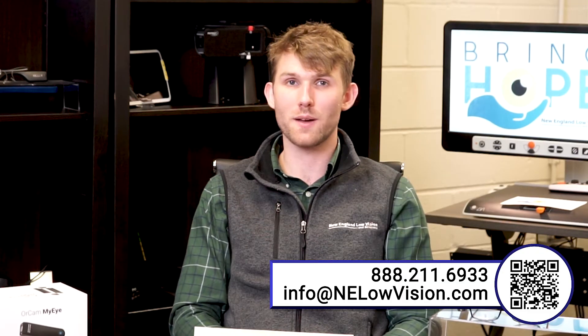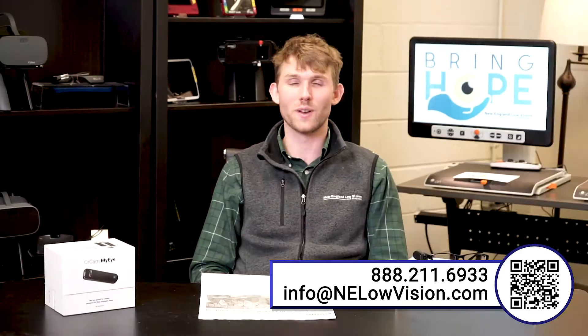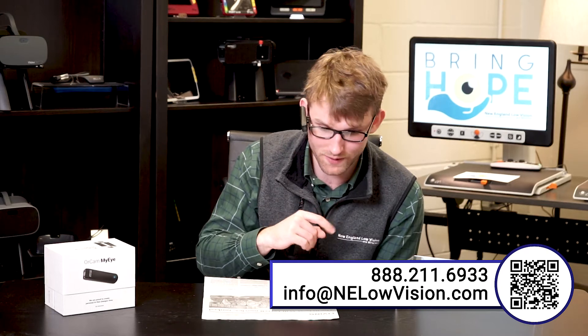Now I'm going to demonstrate the reading with the OrCam MyEye. First, I'll show you how to turn it on — press and hold the power button on the back, it will beep and take a couple of minutes to power on. Now that it's powered on, I'm putting the frames on and I have a Will Ferrell Movies Ranked article in front of me. Getting about 6 inches from the text gives you the best result, so I'll get close and tap the touch bar to initiate the reading.